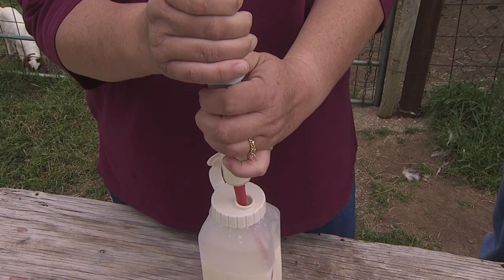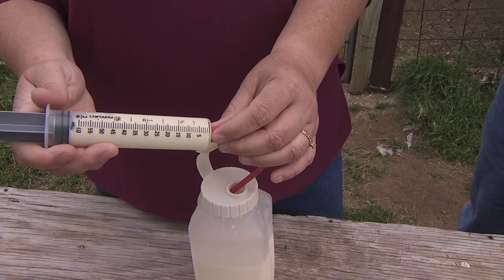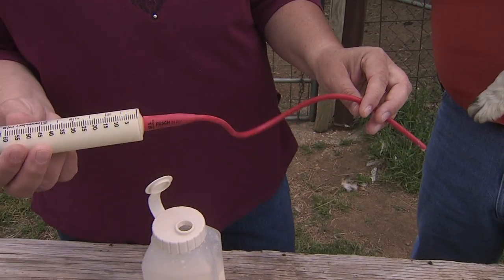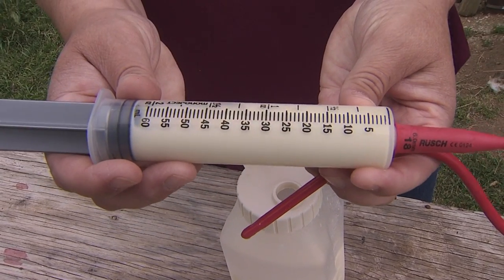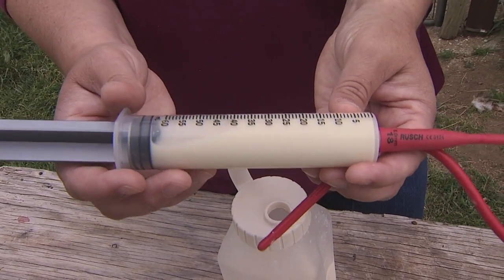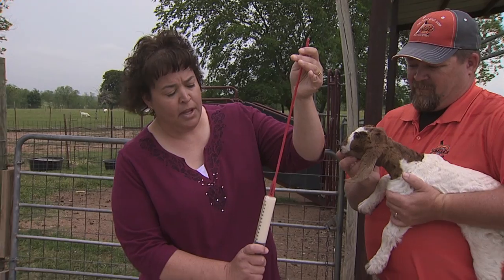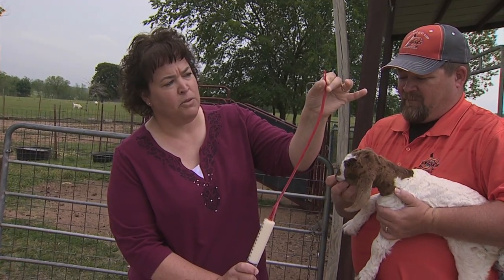You need to draw up your milk — the syringe will show the amount of whatever you are putting in them. We're going to put two ounces in her. Now, see the air bubbles in that? That is not going to kill her if you put it in her stomach — it's not going to do her any good, but it's not going to kill her. What you can do, just like on an injection, is hold it up and force that air out as much as possible — some milk will come out too.